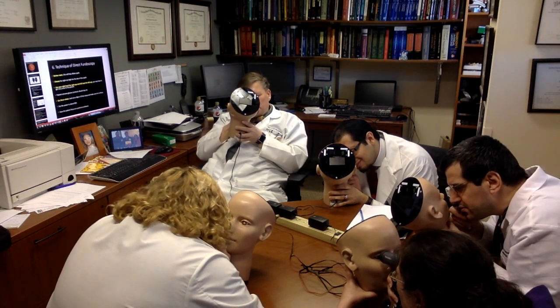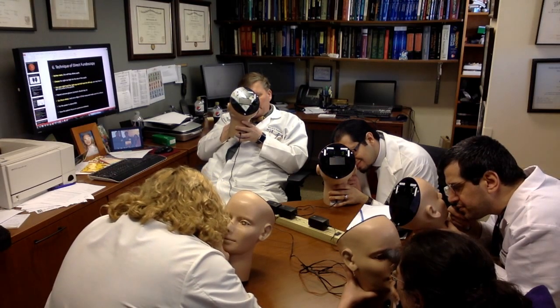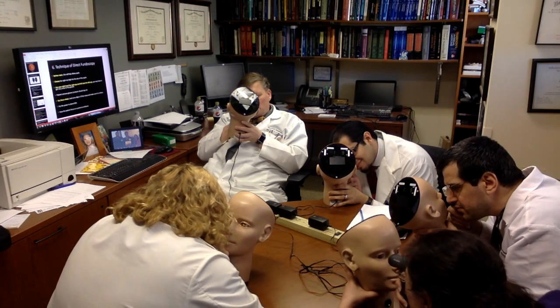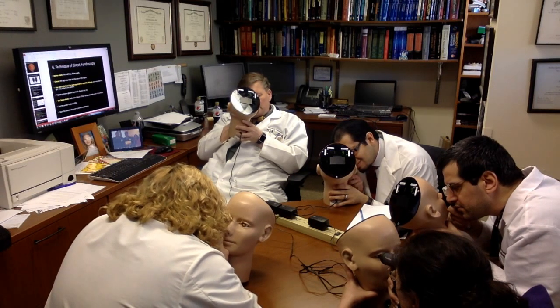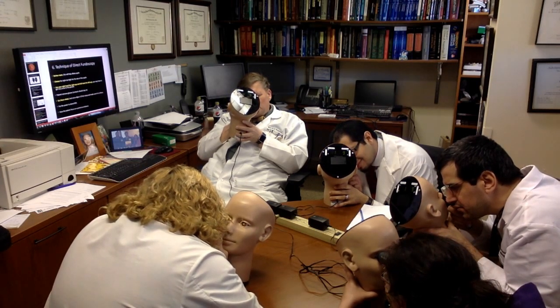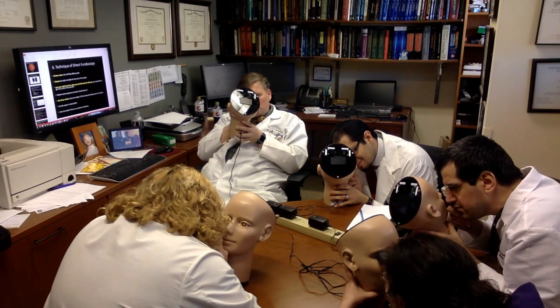Okay, now let's look at the blood vessels that leave the disc. In general, the blood vessels go up and down, but they really go into 4 quadrants. Up and to the left, that's temporal; up and to the right, that's nasal; down and to the left is temporal; down and to the right is nasal. You generally see the blood vessels go in 4 quadrants. Everybody agree? Yes.